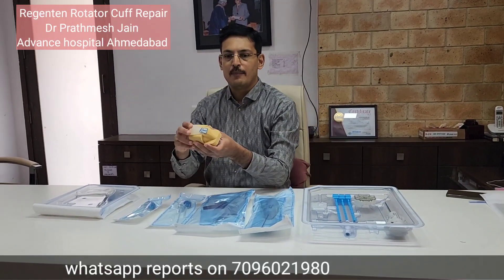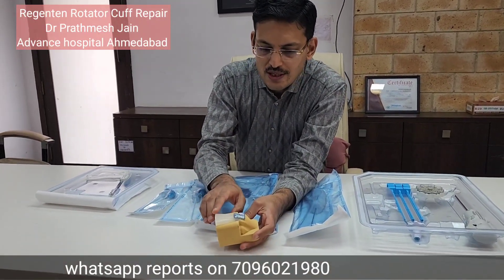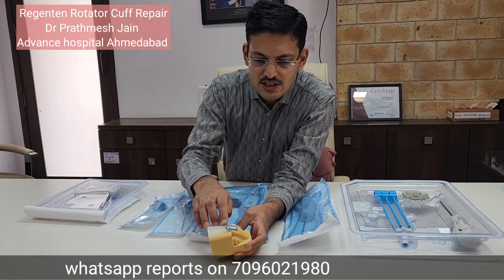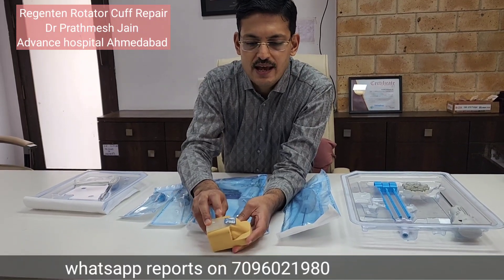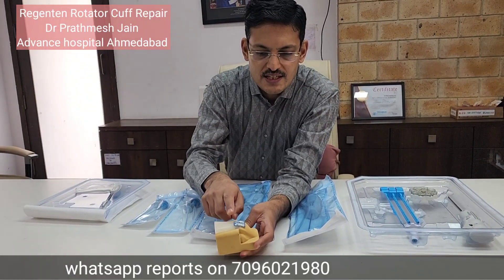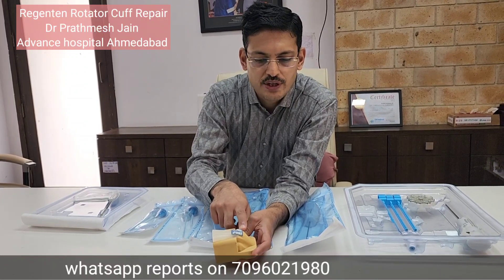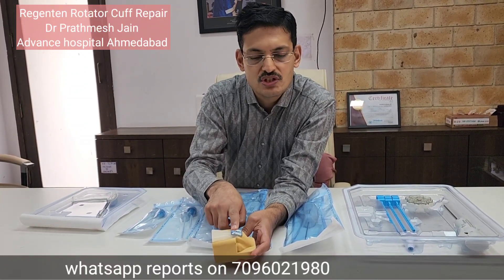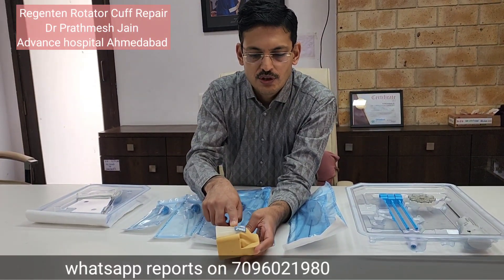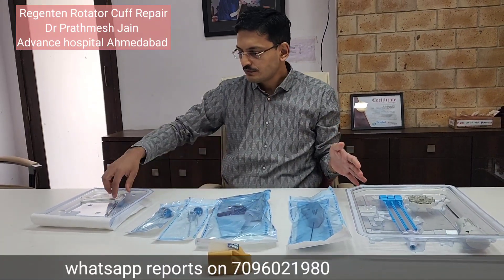The Regenten device is basically a patch — if you can focus here, this is the patch. Consider this as the rotator cuff and this as the shoulder. This patch is available in two sizes: medium and large. This is a medium-sized patch, and it is fixed with tendon anchors on the tendon and bone anchors on the bone. Occasionally we use the large-sized graft as well.